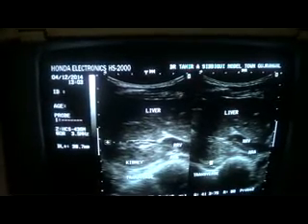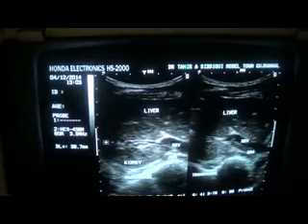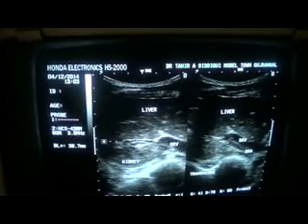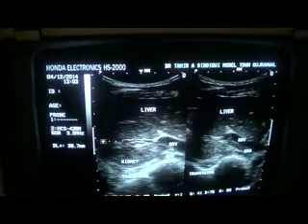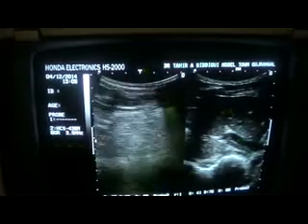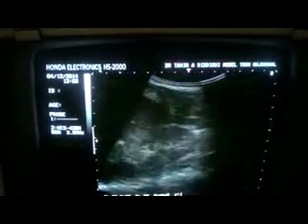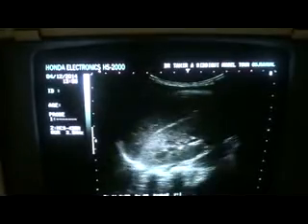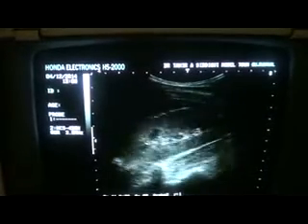Now this is regarding the study of the hilar region of the vessels in a patient with renal parenchymal disease. Now I want to show you, let's study it step by step and see the status of the kidney in this young boy.